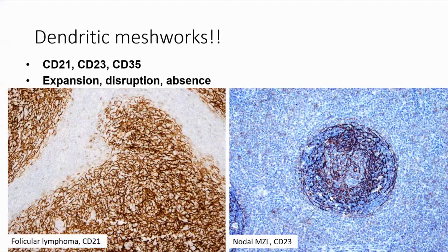Of course, looking for plasma cells and clonal plasma cell proliferations is also potentially helpful, particularly when you're thinking about a lymphoplasmacytic lymphoma or a marginal zone lymphoma. You don't always win. Sometimes the plasma cells are polytypic and it's still a marginal zone lymphoma. But if you do see an associated clonal plasma cell population, that's helpful. And of course, we have a lot of secondary plasma cell stains that can be used as well.